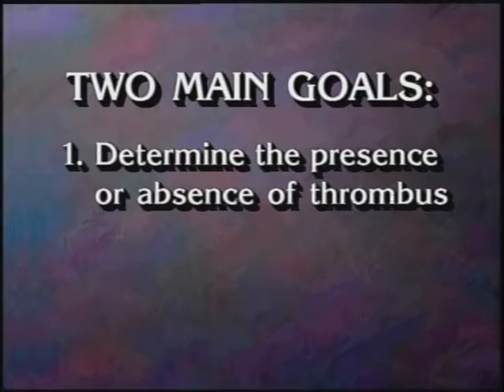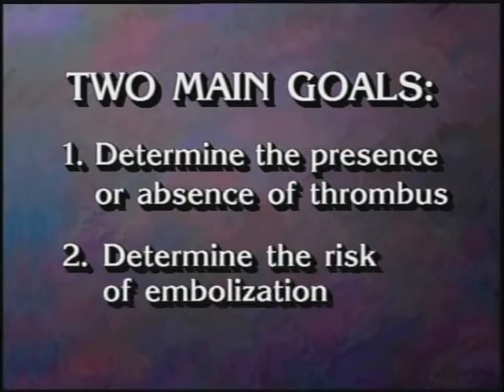The two main goals in diagnosing venous thrombosis are to determine: 1. The presence or absence of intraluminal thrombus, and 2. The relative risk of embolization of the contained thrombus. Venous imaging is uniquely suited to both of these tasks.